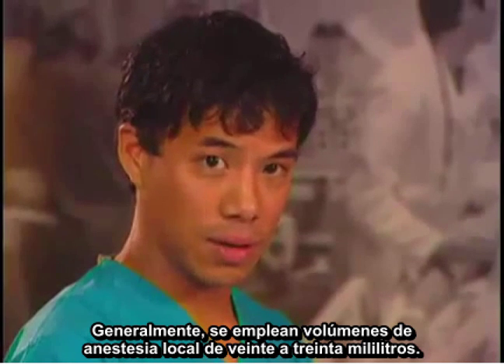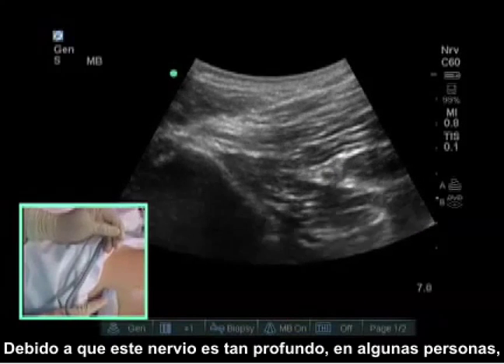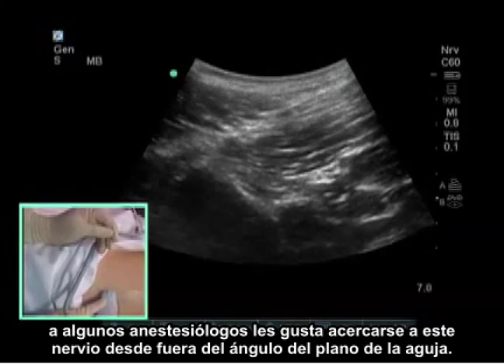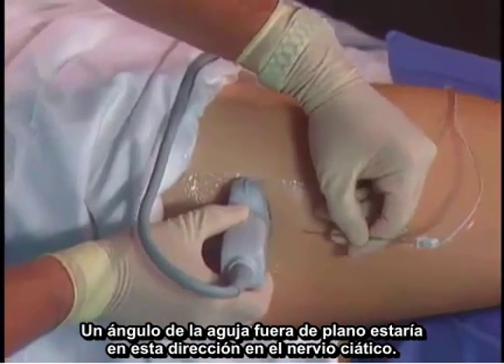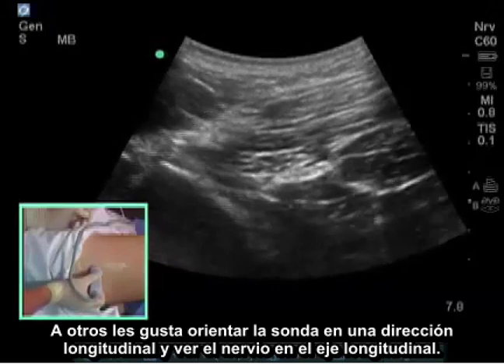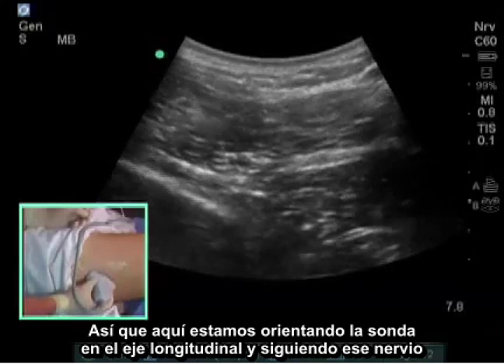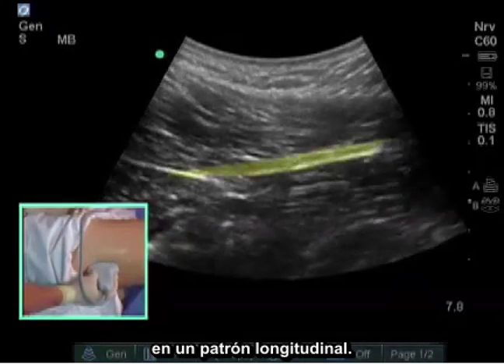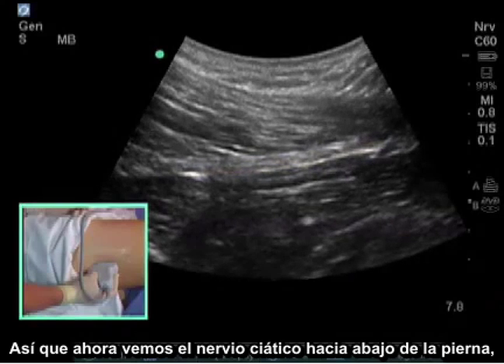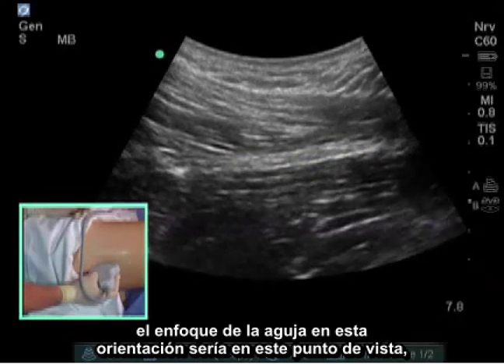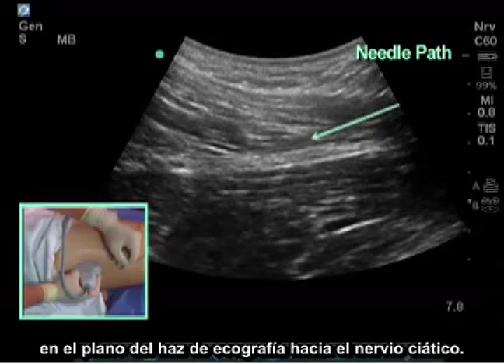Typical volumes are 20 to 30 milliliters of local anesthetic. Because this nerve is so deep in some people, some anesthesiologists like to approach it from an out-of-plane needle angle in the direction of the sciatic nerve. Other people like to turn the probe in a longitudinal direction and see the nerve in long axis, following that nerve in a longitudinal pattern. The needle approach in this orientation would be in-plane with the ultrasound beam down to the sciatic nerve.